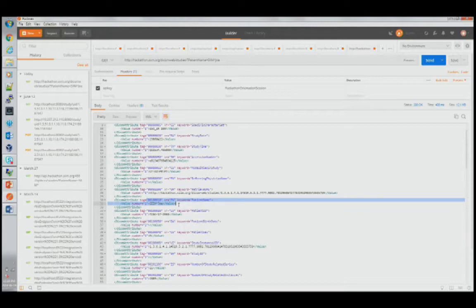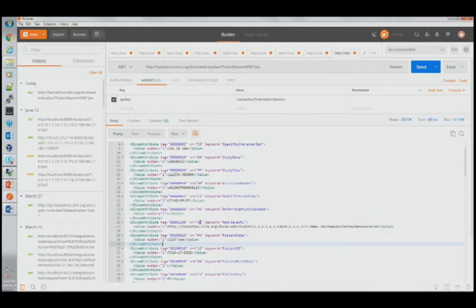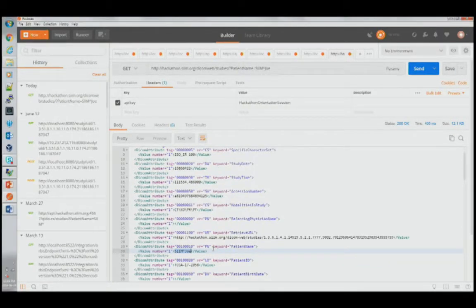But anyway, as you go on, you'll find some more interesting information. So for example, here we have the patient name. Let me zoom in, make this a little bit more readable. Everybody, is this better? A bit more readable? Yeah, I apologize about that. So here we have the patient name, and again with the curious format choices. The format here is last name, then a caret, and then the first name. If you have more parts to the name, you'll have more carets. Again, a little bit of an acquired taste, but if you're ever going to be working with DICOM web, you're not going to be reinventing the wheel and writing your own library to parse this stuff. You're going to have an existing library like dcm4che, and it will provide all that information readily for you. You're not going to have to go through all the nitty-gritty details.